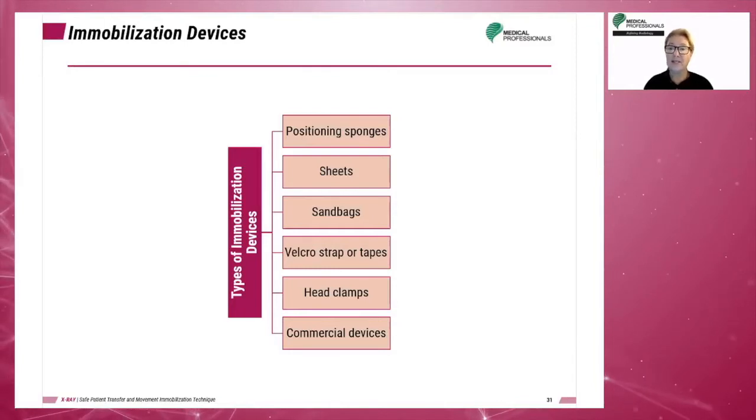Such immobilization devices are very specific. The cervical collar is used only for the neck when there is a case of suspected fracture. Similarly, the spine board is used for spinal injuries. Splints and stockinette are used to immobilize the limbs.